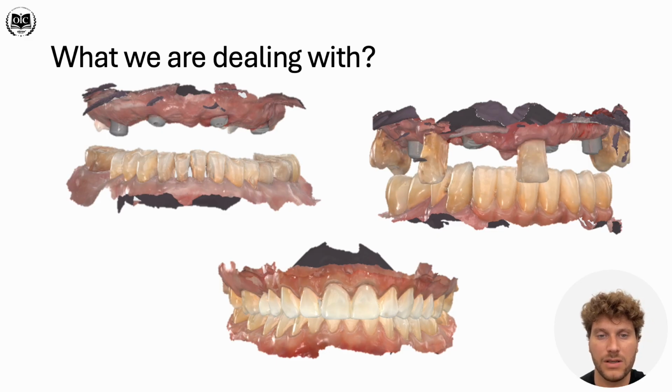Also, we have situations where patients have only a few teeth left, and then we put in implants and have to convert to a fully implant supported restoration with good occlusion and aesthetics. And the majority of cases are those where we have some sort of temporary occlusion and aesthetics, and we then convert it to a better one or the final restoration.